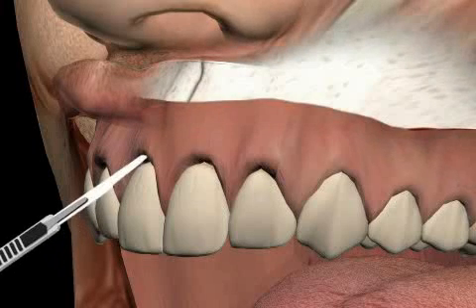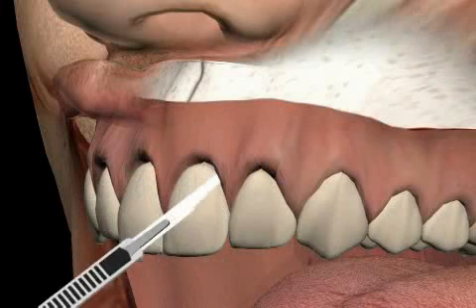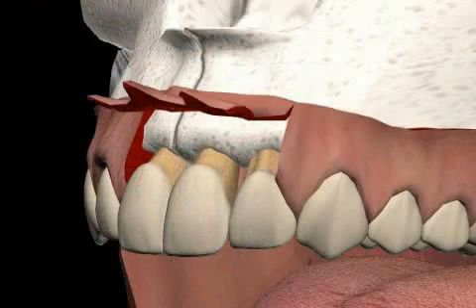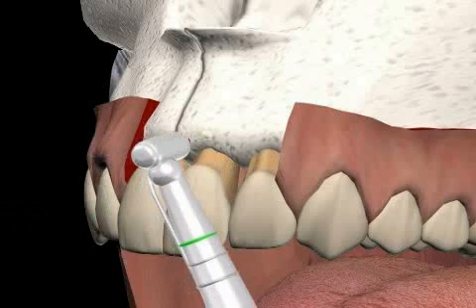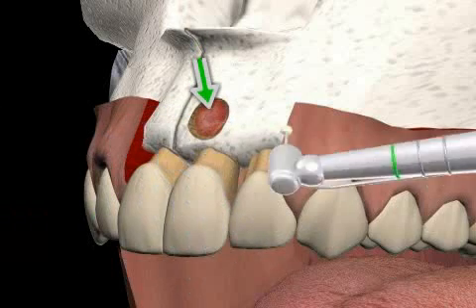Only this will seal the canal tightly. First, the gum is folded back. You can see a gum edge cut. A mucosa lobe is prepared.